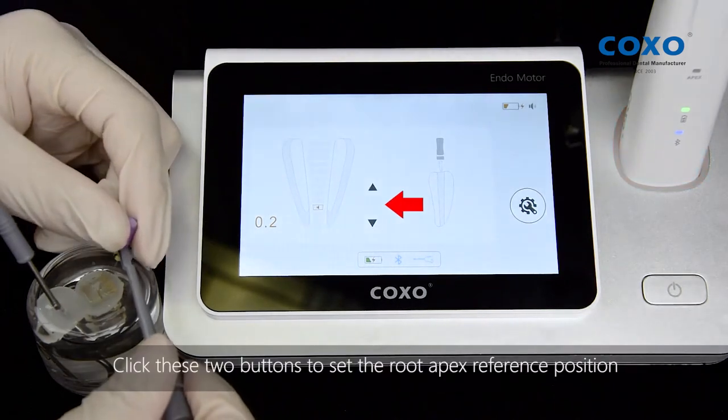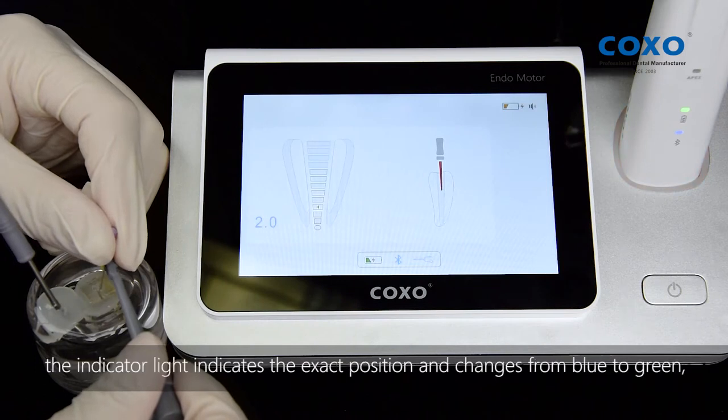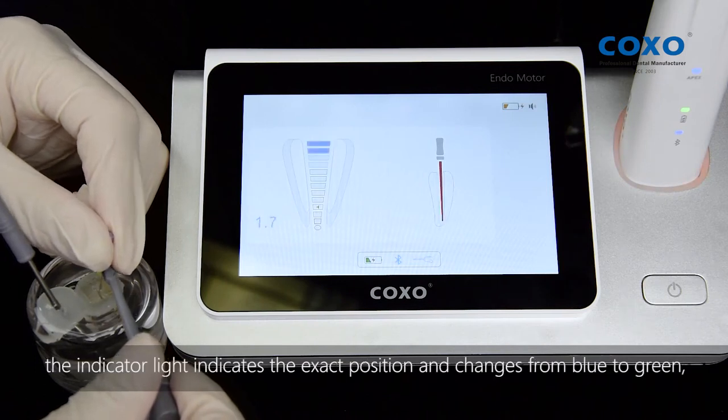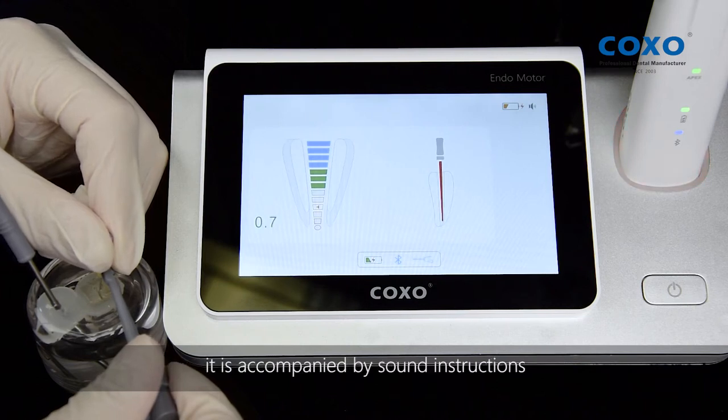Click these two buttons to set the root apex reference position. With the insertion of the file, the indicator light indicates the exact position and changes from blue to green, then to yellow dot. When the Nickel Titanium file moves, it is accompanied by sound instructions.